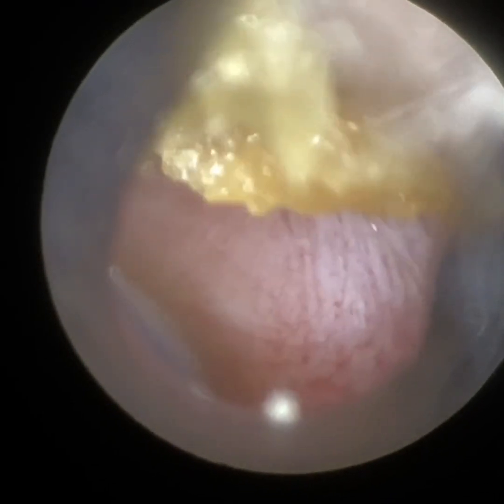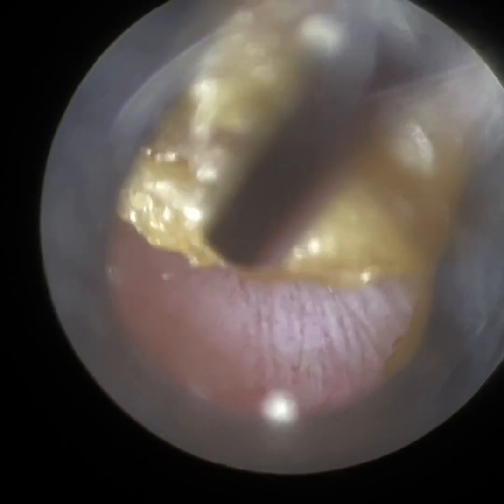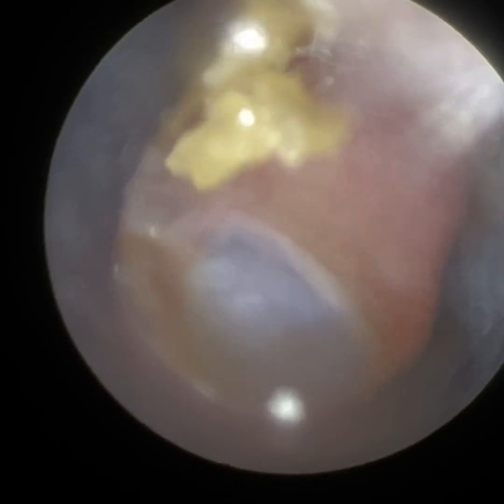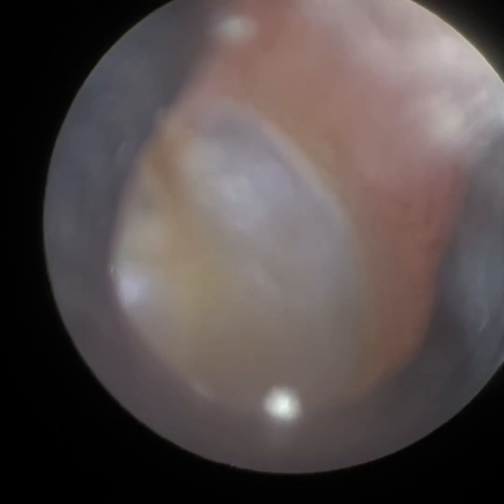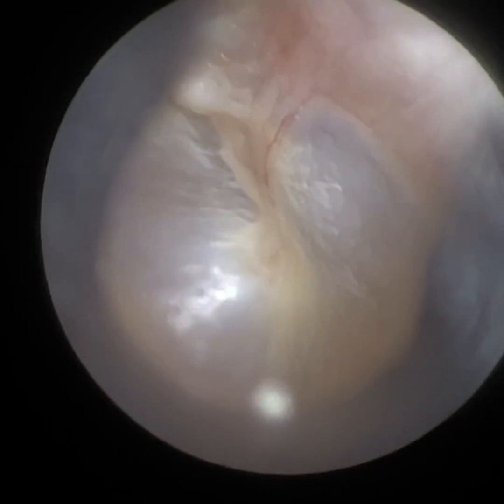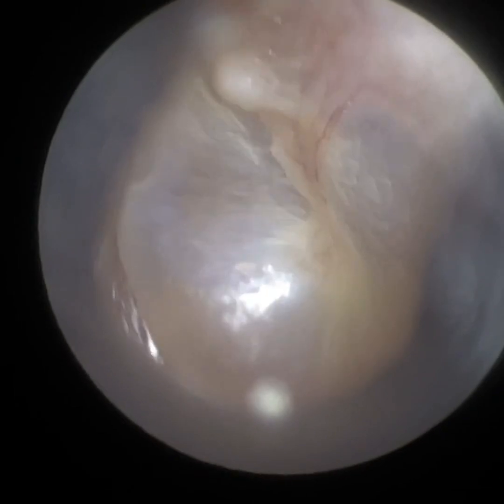You'll have a good view of the eardrum in a moment. So we're just using the fine-end suction probe. The speculum that I'm using here is a 4.25mm, and we're going to have four specula for the WaxScope. The smallest one would be a 3.5mm. This is the 4.25, which I suspect would be the most used size. Then we've got a 5 and a 5.75mm. So this is the patient's right eardrum — you can see it's nice and healthy. The short process is somewhat prominent.